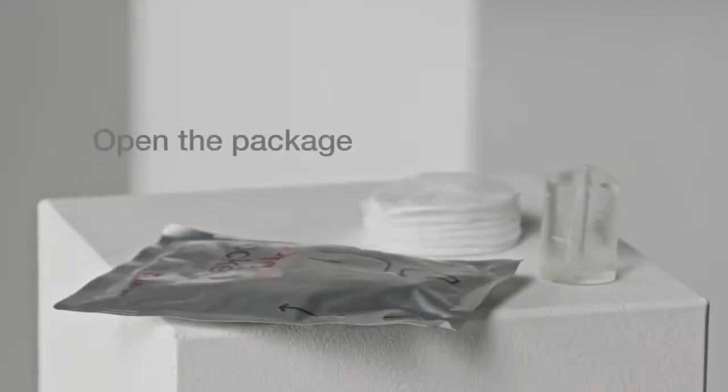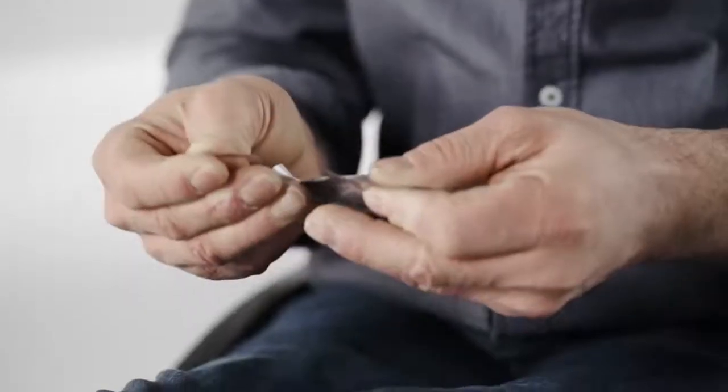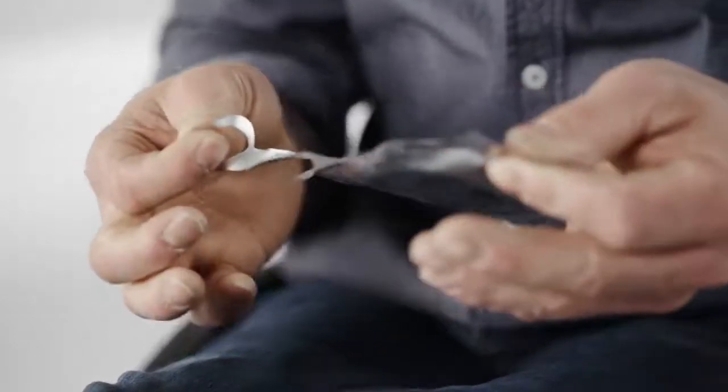Now, open the package. To open the package, pull top finger hole towards you and pull down to open.